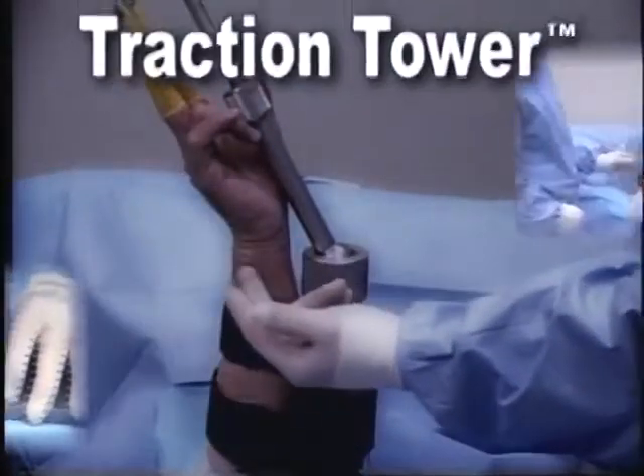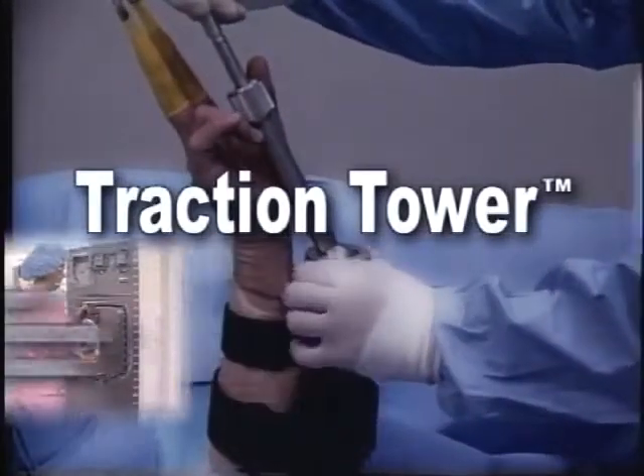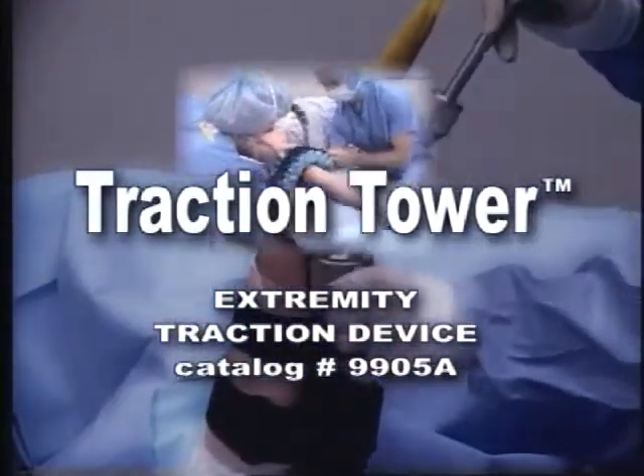The Linvotec Traction Tower device, designed in conjunction with Terry L. Whipple, MD, facilitates wrist, hand, and forearm surgery by providing a freestanding and sterile means of positioning a patient.